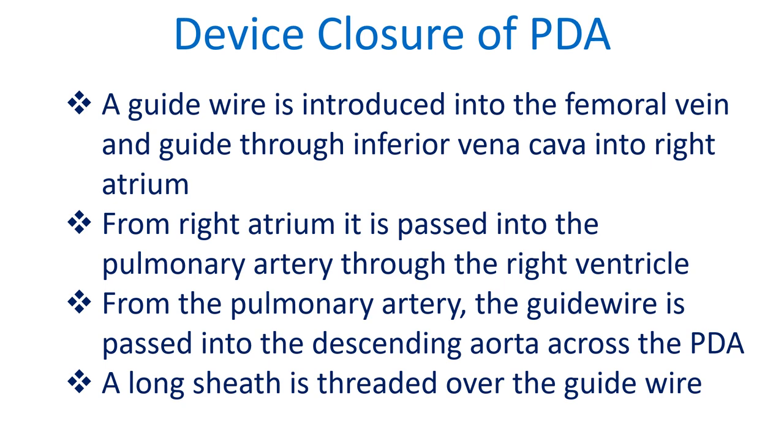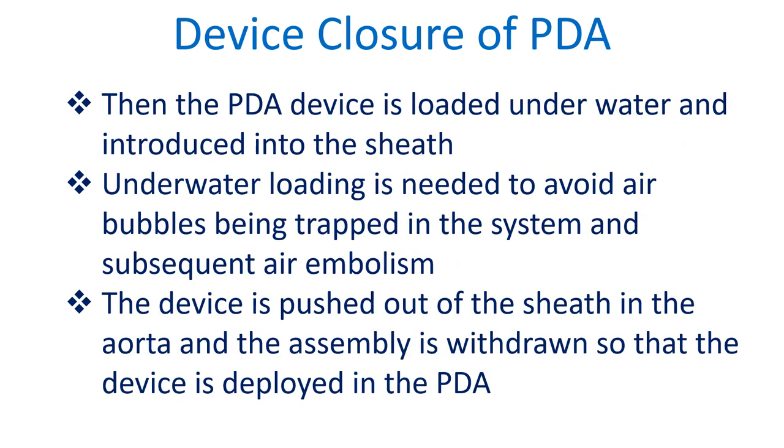A long sheath is threaded over the guide wire. The PDA device is then loaded underwater and introduced into the sheath. Underwater loading is needed to avoid air bubbles being trapped in the system and subsequent air embolism.